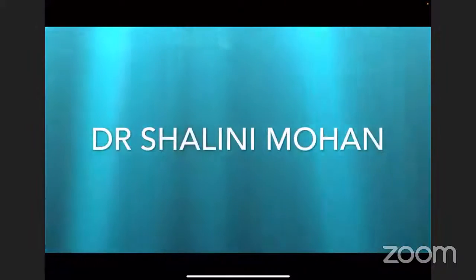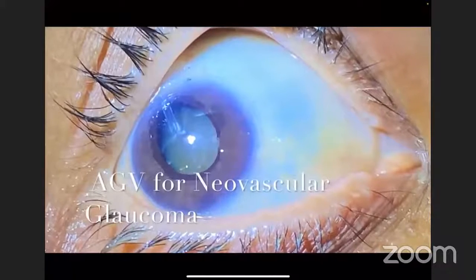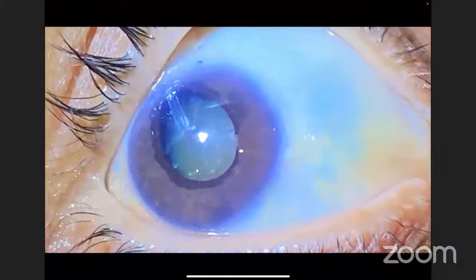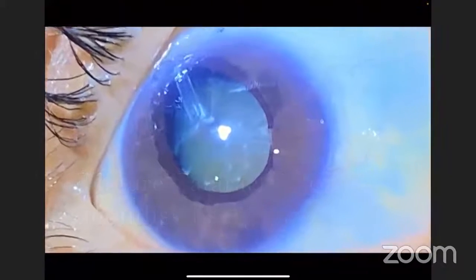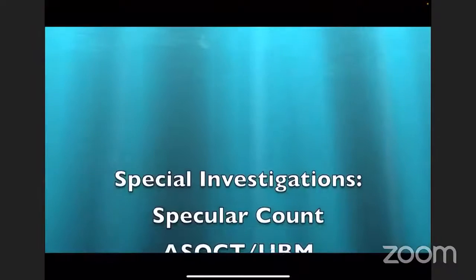Now, we do understand that after glaucoma valve surgery, there are certain subsets of patients who develop cataract. And because of continuous endothelial cell loss noted in these patients, it is a challenge. Now, this is a patient who had neovascular glaucoma, and there was a cataract which formed 9 months after surgery. The intraocular pressure was well controlled.